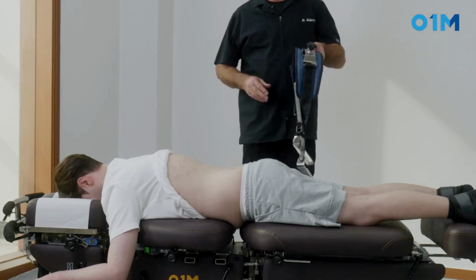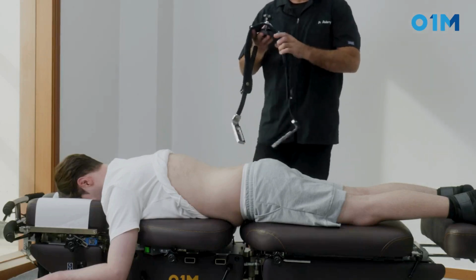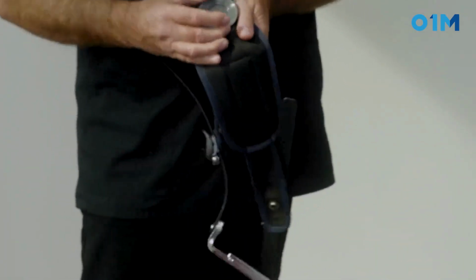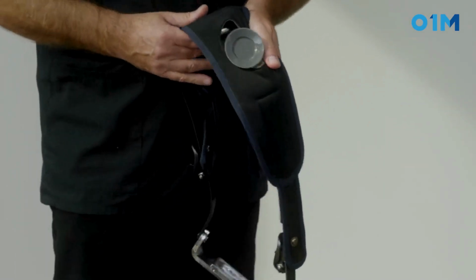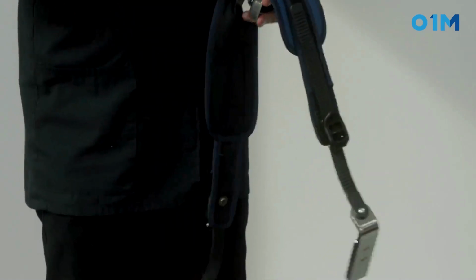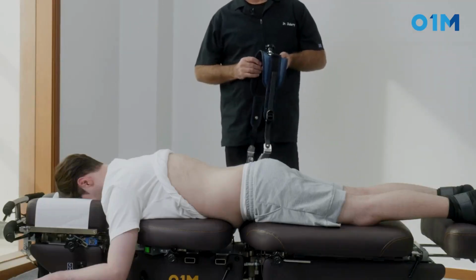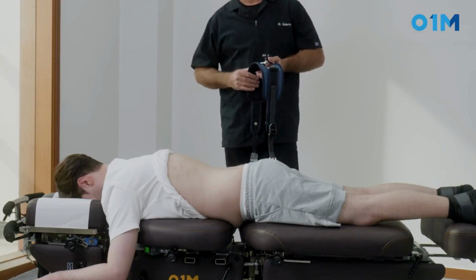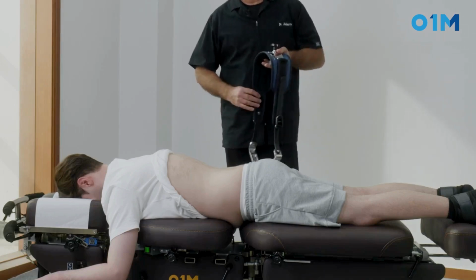Okay, with this table comes a part which is quite interesting. It's basically a smaller belt in width, and in it you have, and I'm going to show you here, a rubber ring that will go directly on the spinous of the lumbar, and it will press it down. So it's interesting to use for retrolisthesis of the lumbar, and very often in some cases where you have a stenosis from a retrolisthesis in the lumbar. So how do you apply it?